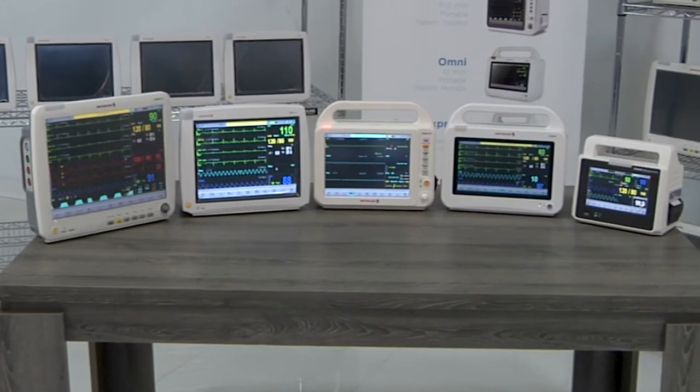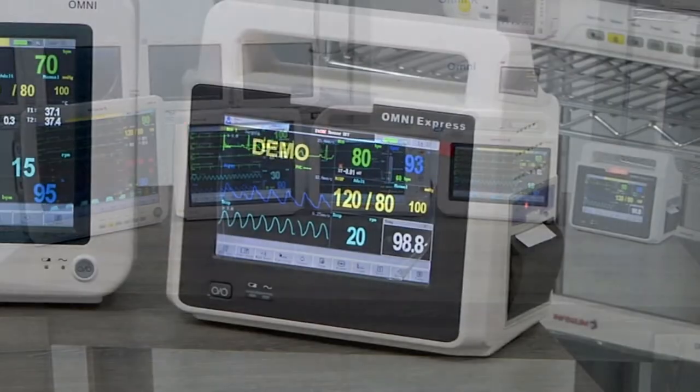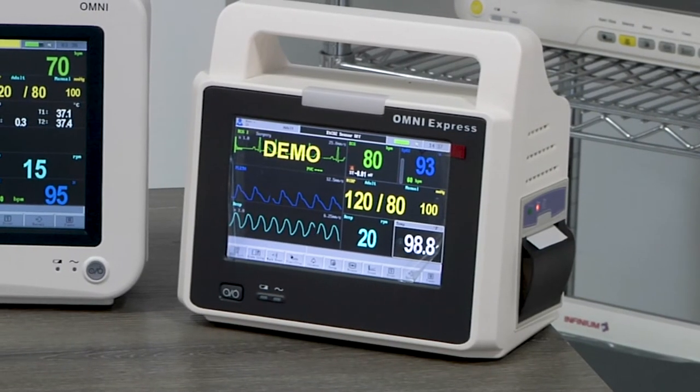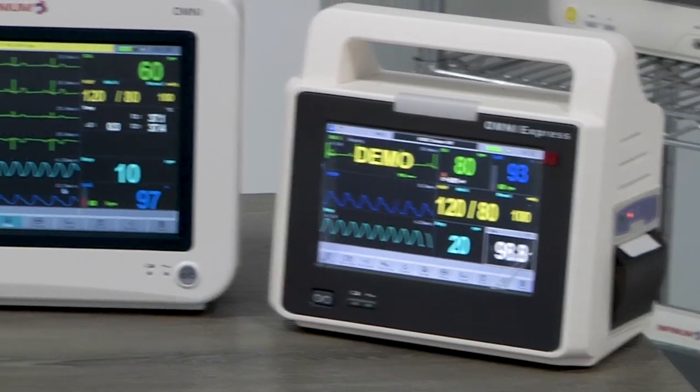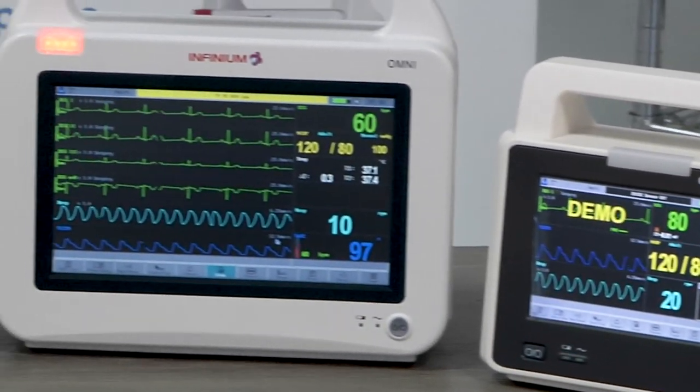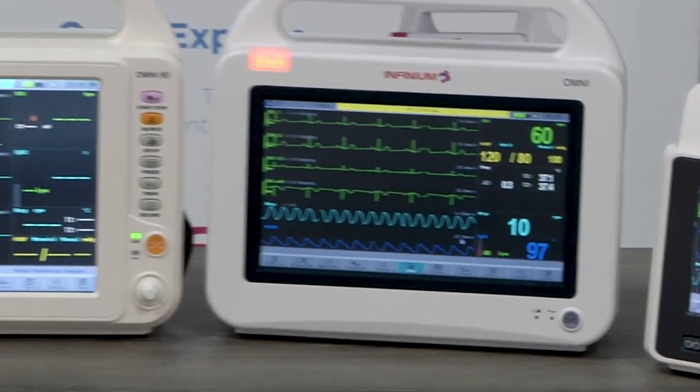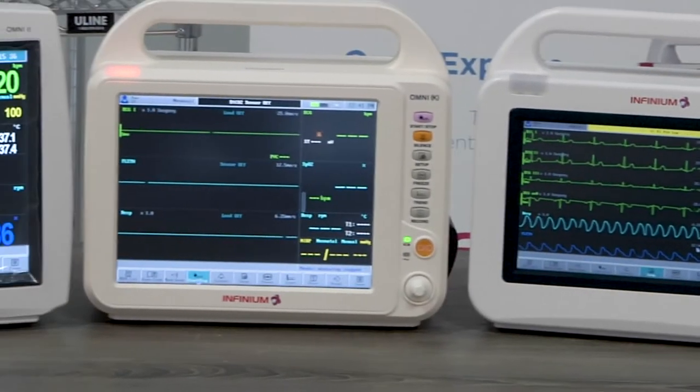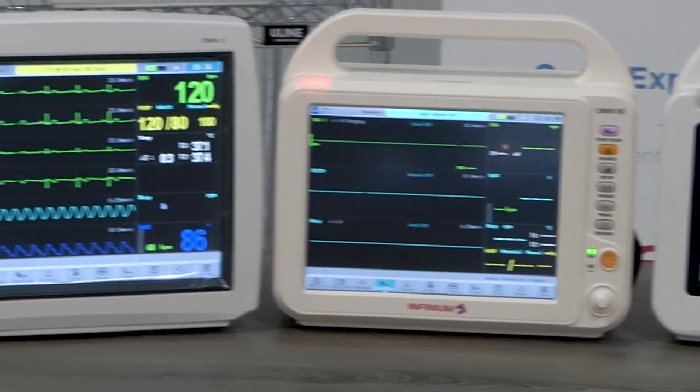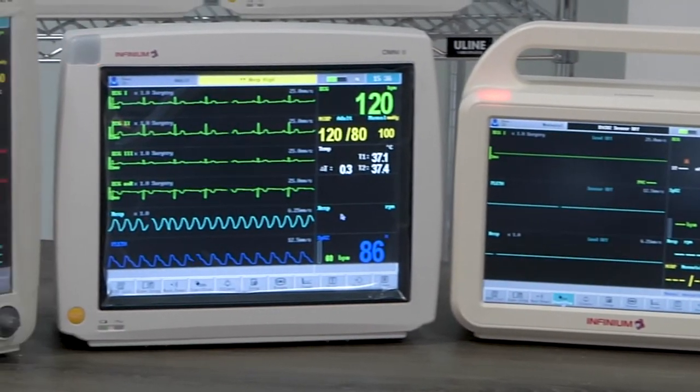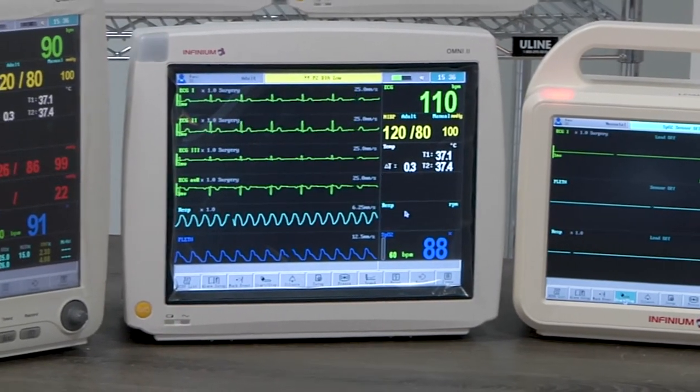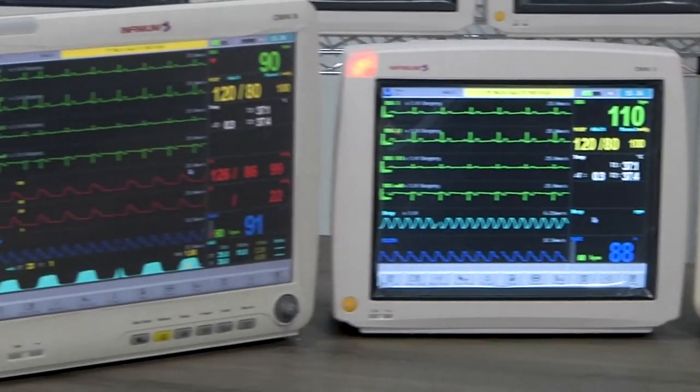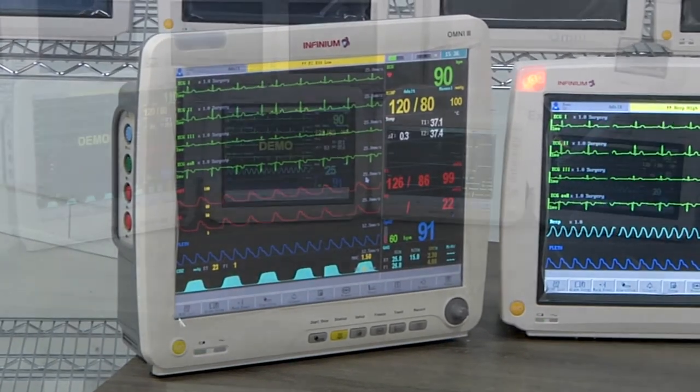These are the Infinium Omni series monitors. We have the Omni Express with a 7 inch display, Omni with a 10 inch display, Omni K with a 10.4 inch display, Omni 2 and Omni 2K with 12 inch displays, and the Omni 3K with a 15 inch display.